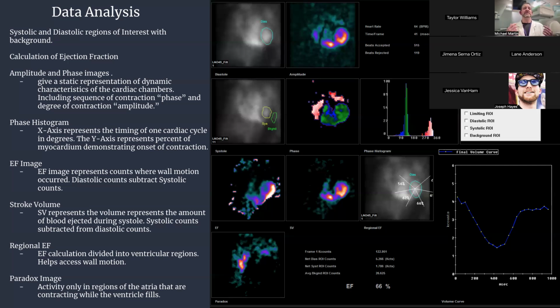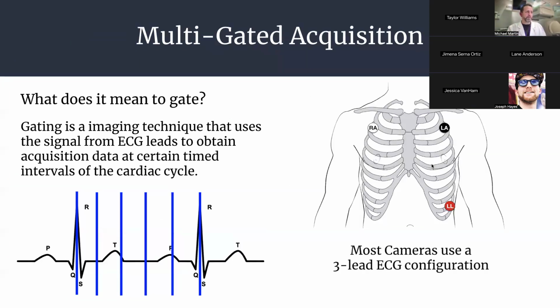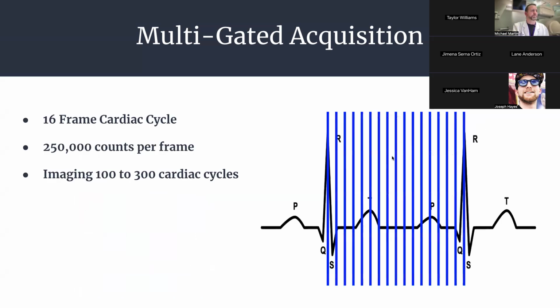The other thing I'll have you think about is, maybe I'll just go back real quick. On our image way back at the beginning when we talked about the EKG right here, even though this is where these leads are designed to be, don't feel scared in moving these around until you get a good R wave. The reason I say that is because these three leads are not diagnosing an EKG. It's not a diagnostic EKG. I'm not going to look at that and try to say, okay, this patient's got ST depression or ST elevation, or they've got this kind of rhythm, right? All you're trying to do is get the R to R. So you need a good R wave. So don't be afraid to move them. I mean, try to get the best you can. Try to go in the configuration that it's supposed to be in, but don't be afraid to move them around until you get a good signal.